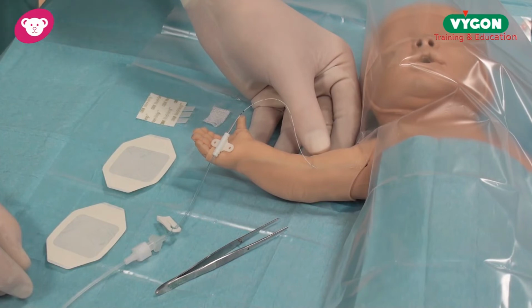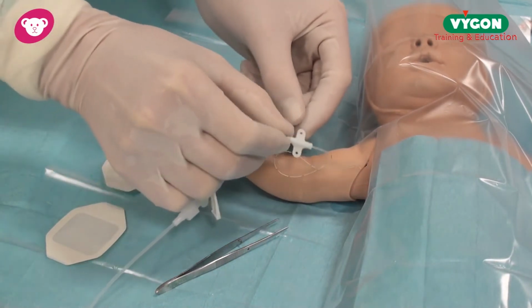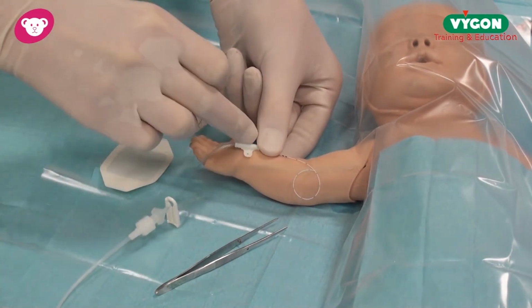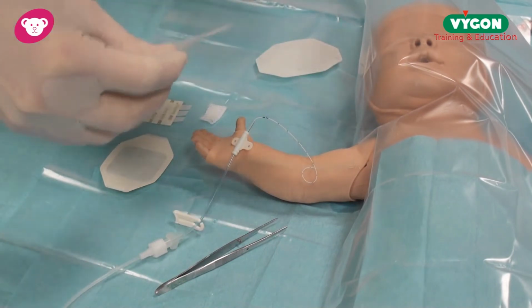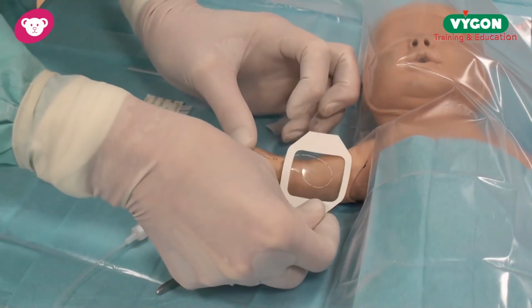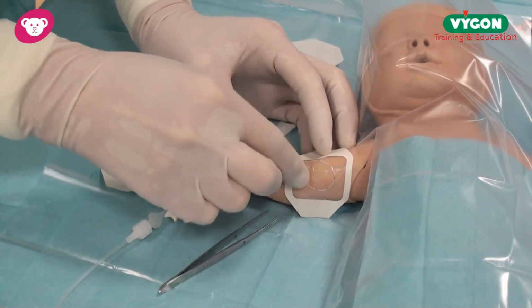I'm now going to make sure that the catheter is stabilized, and this is an essential part of the procedure of PICC placement. Firstly, I'm going to curl the catheter at the entry site like so, very gently, and this is where I put my first dressing on. It can be very difficult for a one-person technique, so please bear with me. So I get my Tegaderm ready, and I'm going to curl the catheter, and this is my first Tegaderm at this point. Place my first Tegaderm over and secure the catheter in place.